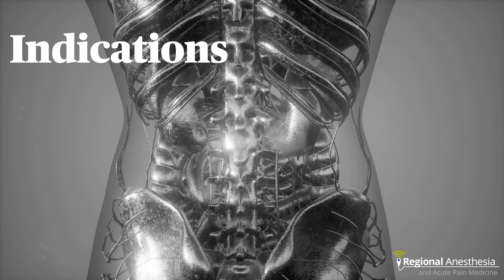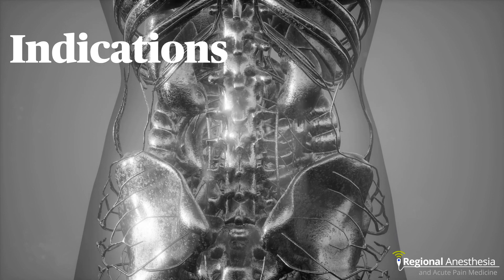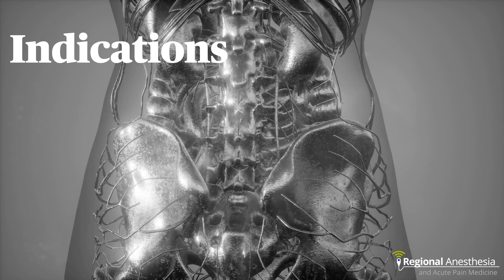Catheters are placed using the same technique. Once the pleura is depressed, the catheter is gently advanced a few centimeters into the paravertebral space.